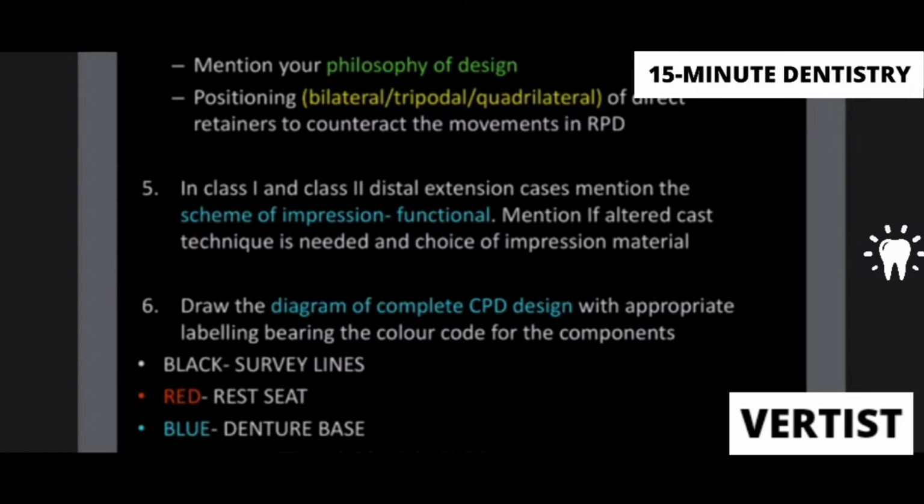So this is what, click a screenshot. This is how you're supposed to follow if you have to design a cast partial denture or you've been asked in your viva, how are you going to design? This is the sequence that you're going to follow.